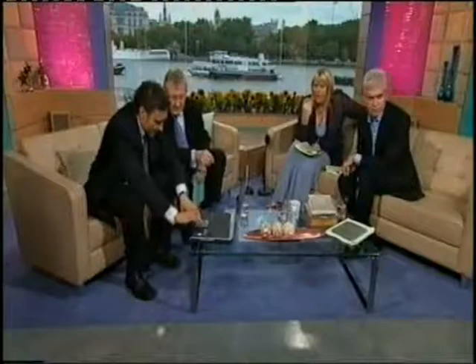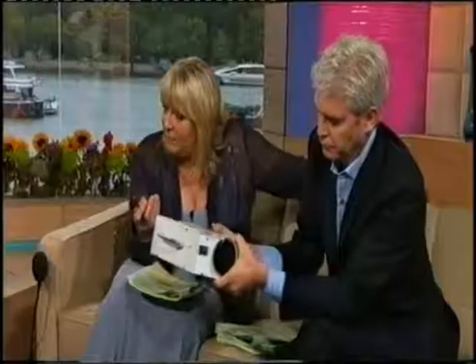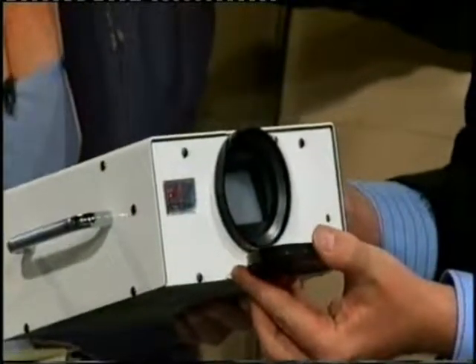I can show you an example. While you're finding that, the wonderful thing is that mammograms, of course, are quite uncomfortable because you have to have your breast literally squashed between two plates. But this is standing in front of something that looks like a little video camera. This is the camera. It's basically just like having your picture taken. So there's no pain, nothing intrusive. No compression. If you had a tumour that you hadn't detected, quite an advanced tumour, it would see that as well. I'm going to show you an example of someone with known breast cancer, and you'll see instantly the difference.